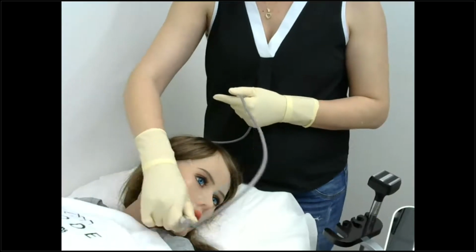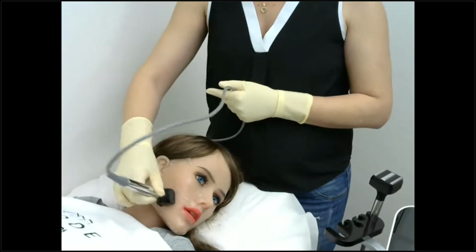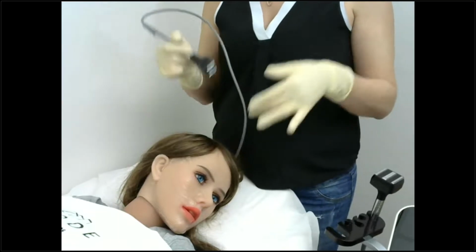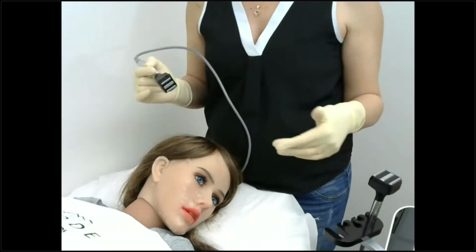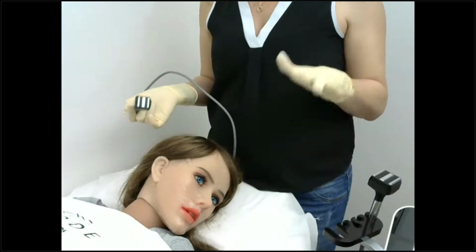It doesn't matter, you can do this or that. It makes no difference as long as you're applying the applicator perpendicular, slightly pressed, maintaining full contact, and your patient is comfortable and you're comfortable. These are the things that you have to make sure of.